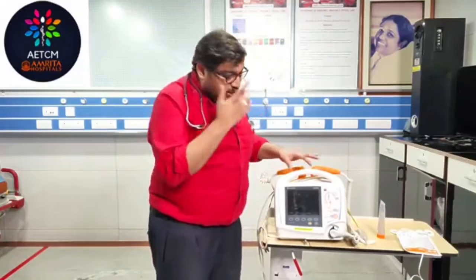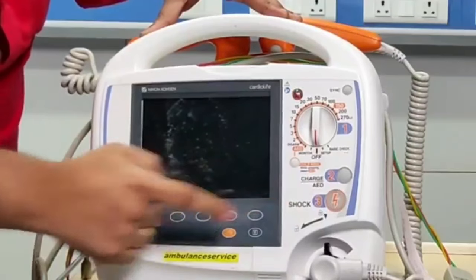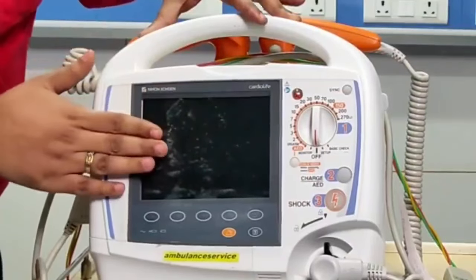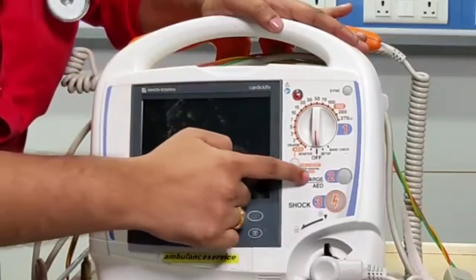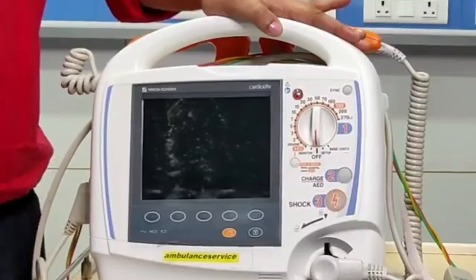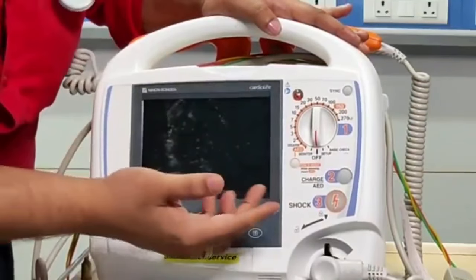I'll quickly see what the parts of a defibrillator are. You will have a monitor screen like this, and you will have an energy selection button. As I told, this is a Nihon Kohden one, and this has an inbuilt AED mode, that is automated external defibrillator mode, as well as a pacing mode available in this defibrillator. So these are the parts of a defibrillator.